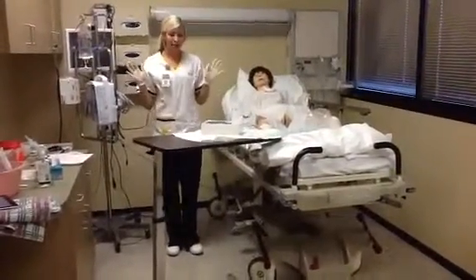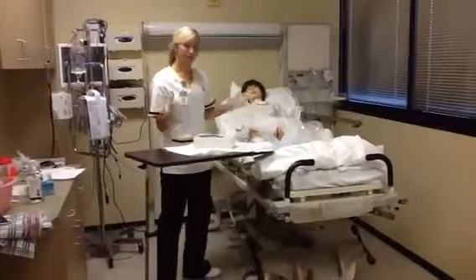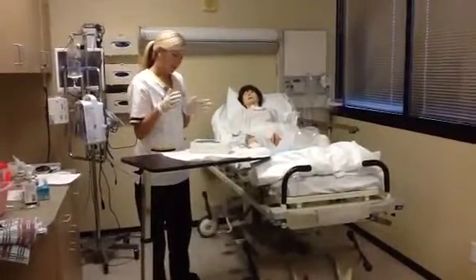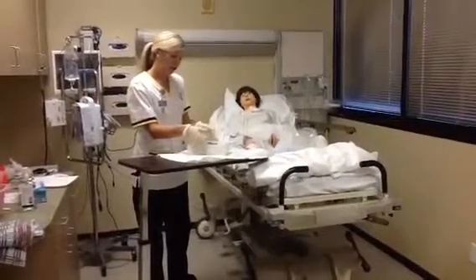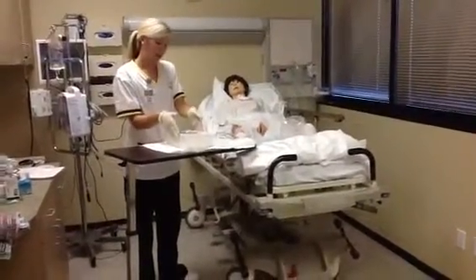Okay, now that I've done that, I'm going to come back to my sterile field over here, again, making sure never to turn my back. And I'm going to reposition my box and take the lid off.